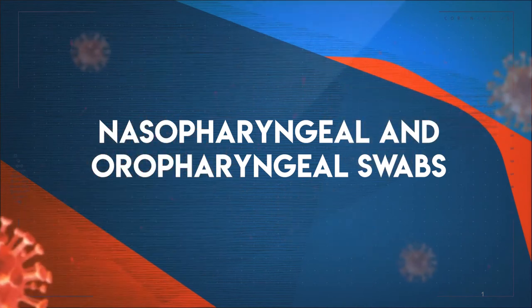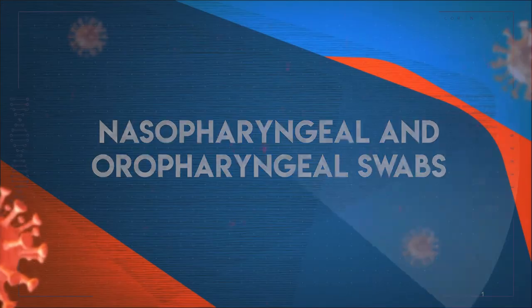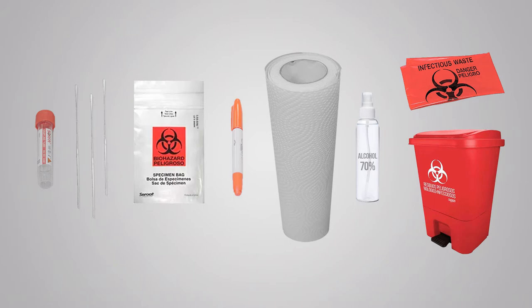Nasopharyngeal and oropharyngeal swabs — materials needed. It is important to verify that you have all the necessary materials: sample collection tubes, swabs, transport bag, marker, paper towel, 70% alcohol or gel alcohol, and a container for biological waste.